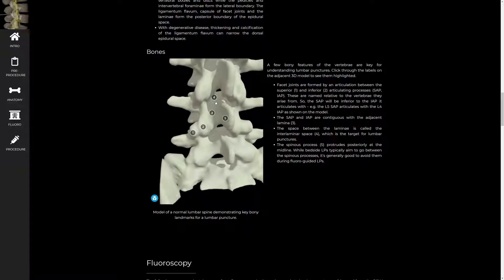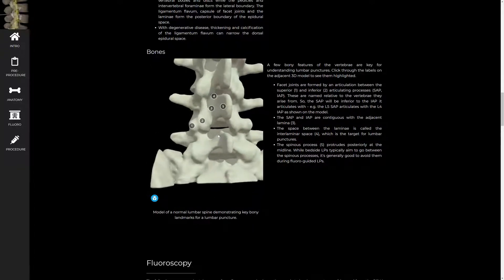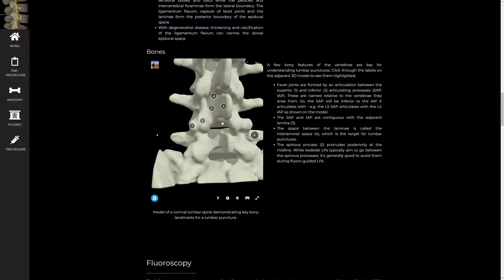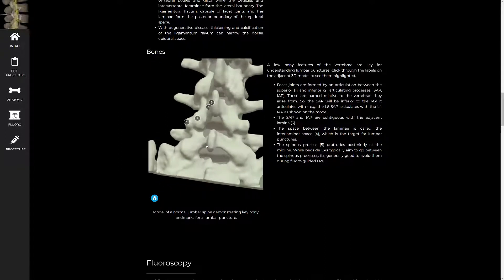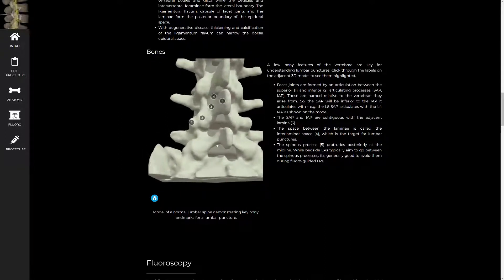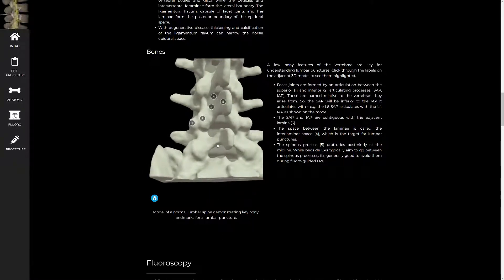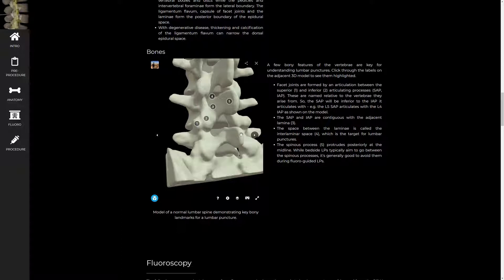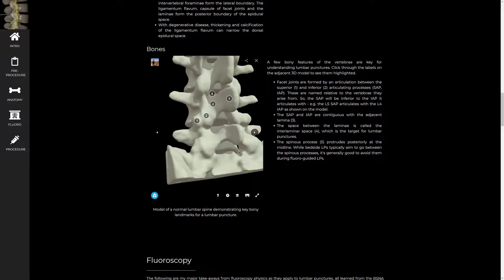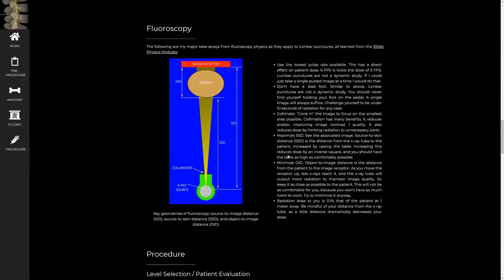Then the last landmark I want to mention is the interlaminar space. That's our target. So you see you have lamina here. You have lamina here. The space in between is the interlaminar space. And that's how we get into the spinal canal. One thing to note, this is how it looks. If you rotate a patient oblique, it tends to open it up a little bit and make it more prominent. Not critically important in young, healthy people. But as you get more degenerative disease, that can be a really helpful tool to help open up your target.